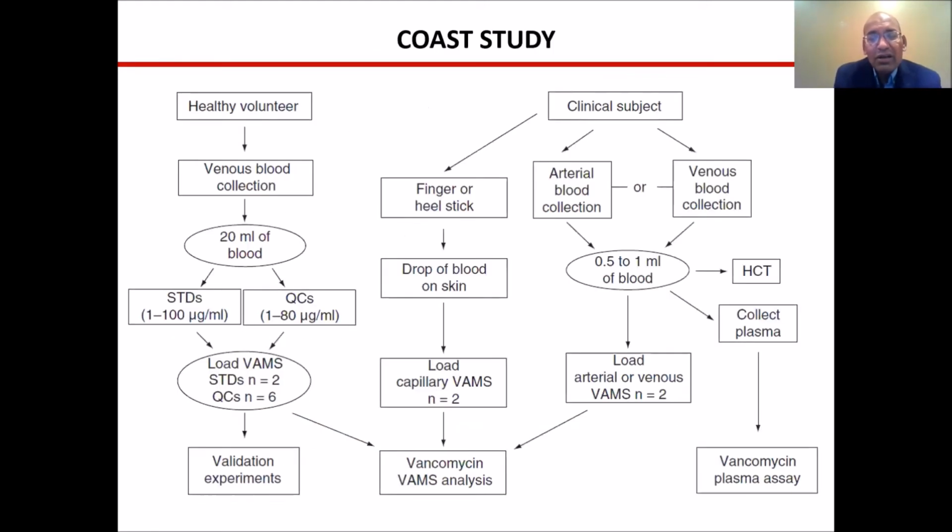So I'm going to talk briefly about this COAST study. Again, as we have seen earlier, we performed the validation or sample analysis using the scheme on the left.